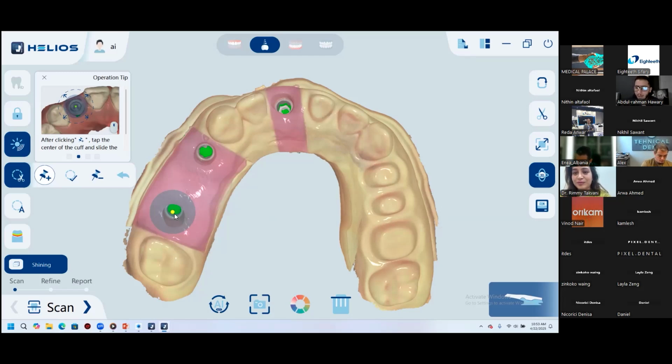But most scanners available in the market nowadays are actually video based. But yes, like Dr. Remy shared with us, you do have to actually evaluate, because there are too many marketing campaigns now available in the market. They keep on using numbers within their brochures, and most users do not know the background of these numbers, or how to calculate or evaluate such numbers.